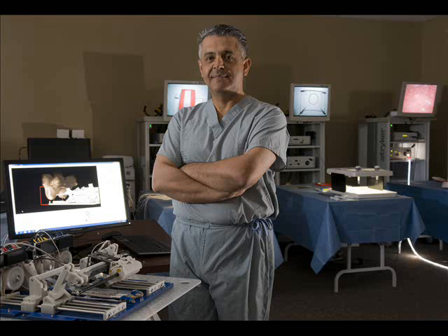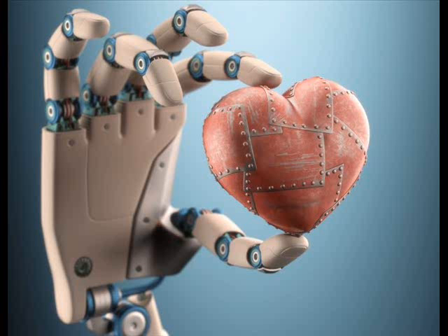Cardiology and electrophysiology. As of 2004, 3 types of heart surgery are being performed on a routine basis using robotic surgery systems. These 3 surgery types were: atrial septal defect repair, the repair of a hole between the 2 upper chambers of the heart; mitral valve repair, the repair of the valve that prevents blood from regurgitating back into the upper heart chambers during contractions of the heart; and coronary artery bypass, rerouting of blood supply by bypassing blocked arteries that provide blood to the heart.